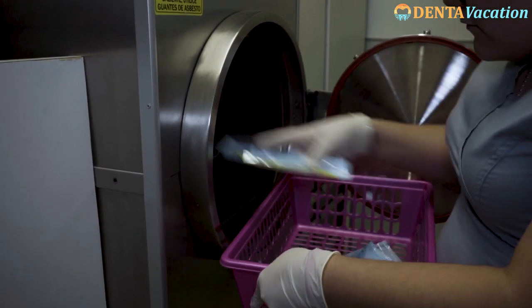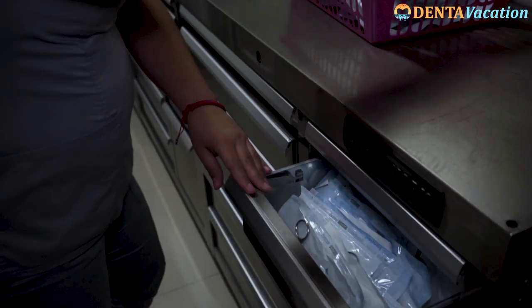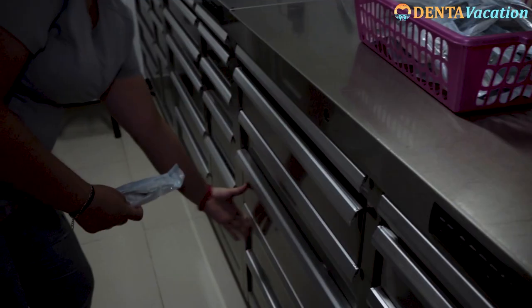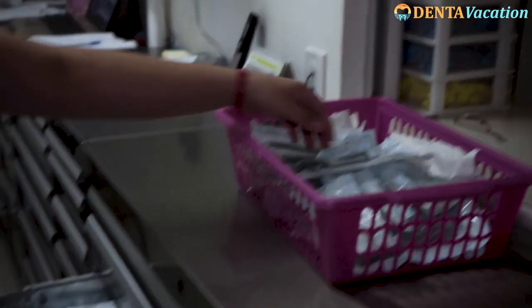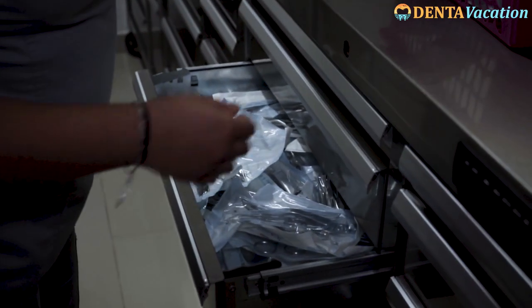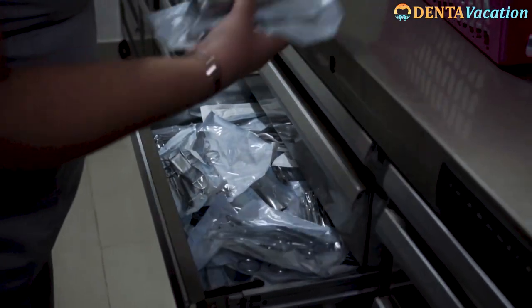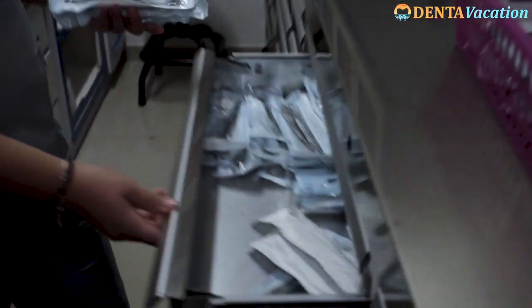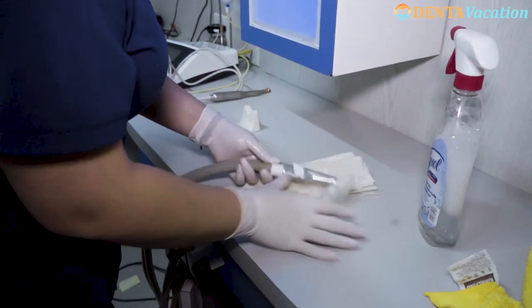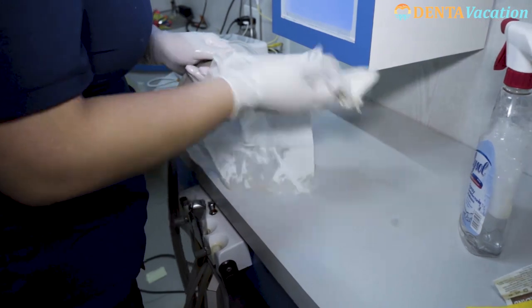The pouches are allowed to dry in the autoclave, after which they are transferred to the designated storage areas. The sterilized instruments are then ready to be used.